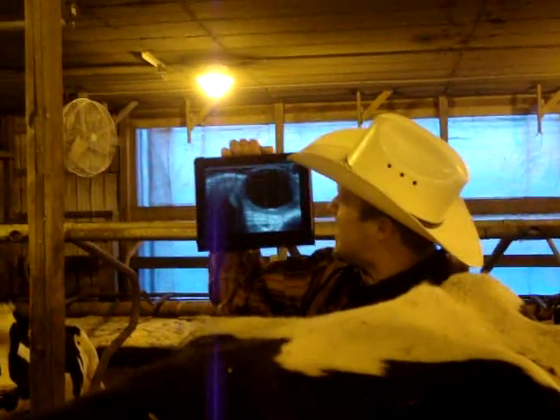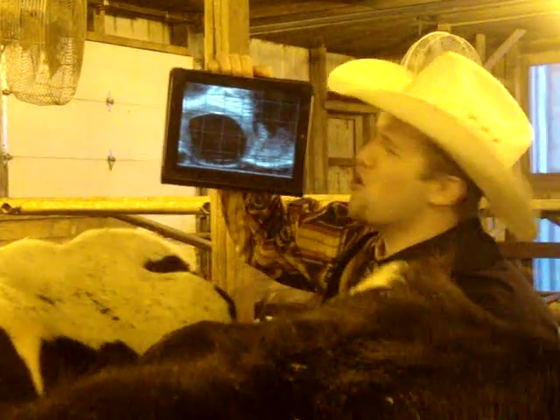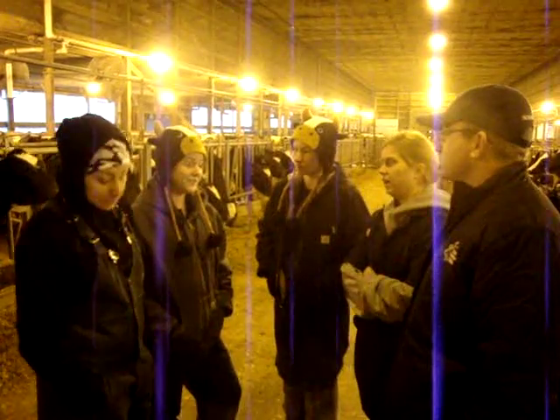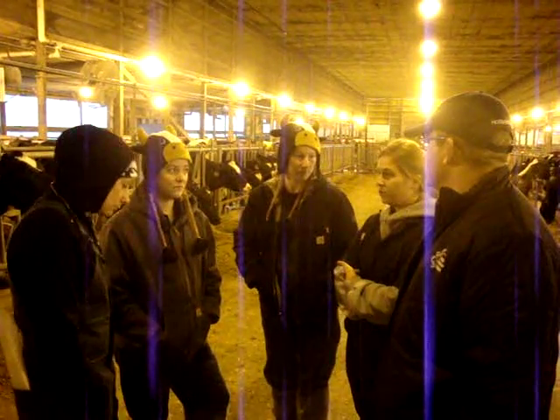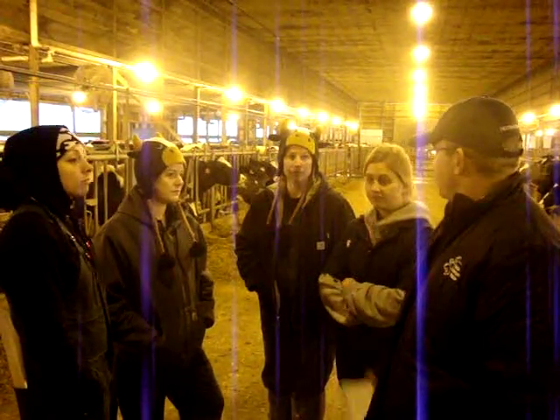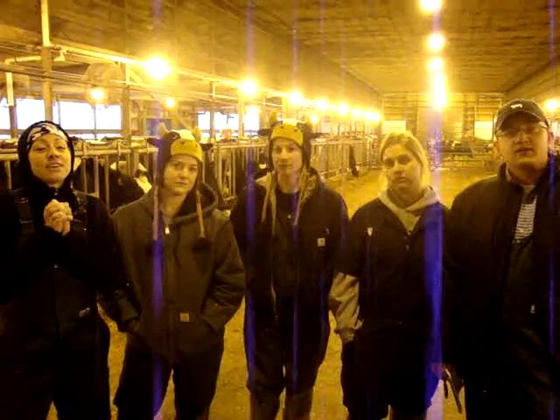So this is what you're gonna be seeing on an ultrasound — in this towel here, pretty much exactly. This one here is a lot different — whole new picture. Very similar to that. [Students]: Isn't that the picture he just showed us? I think so. Man, I'm not learning anything from this. You know, a BCF Technologies device — the EasyScan machine — that would help a lot. Hey y'all, you gotta come look at this one down here. BCF, please help us!